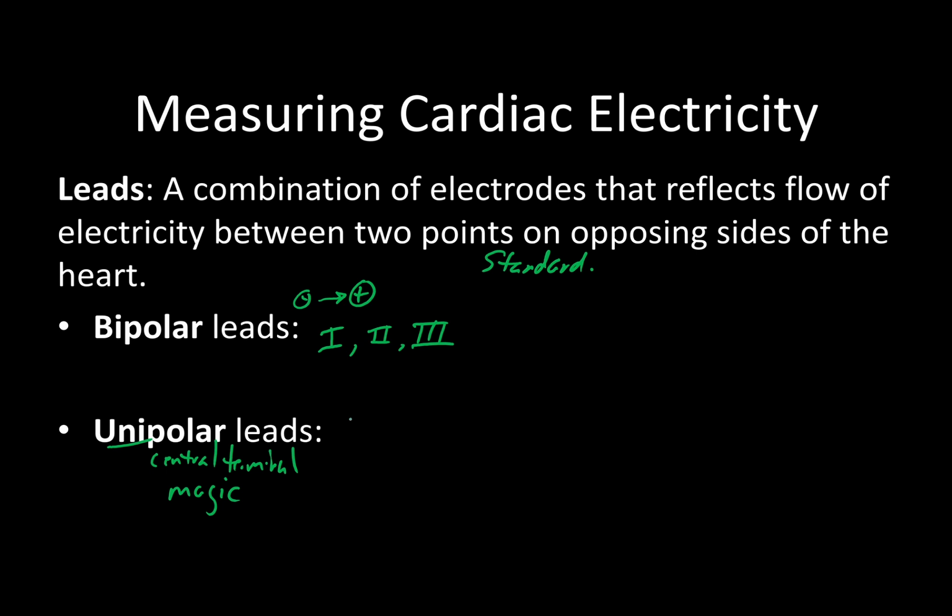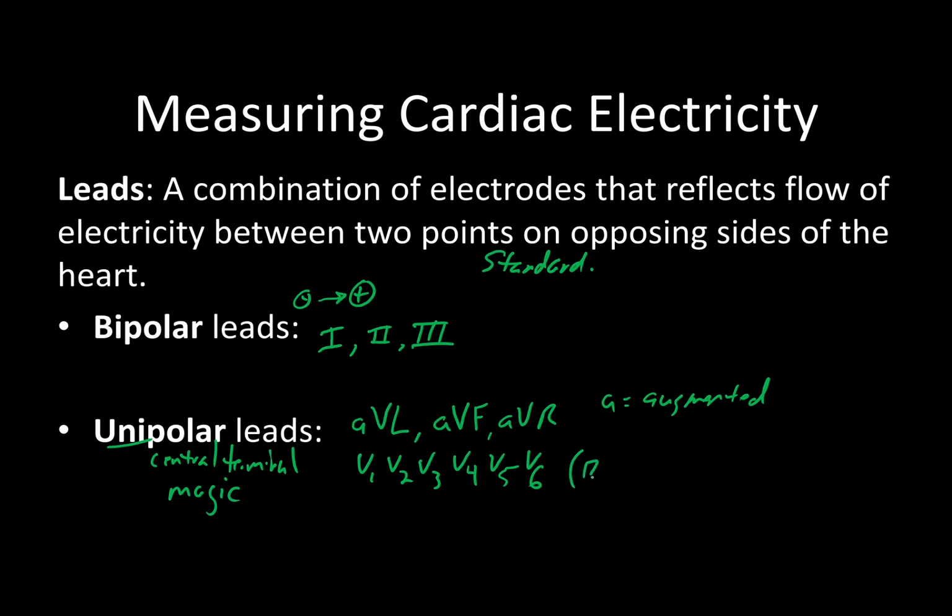And the most common leads that you will see with that is your AVL, your AVF, and your AVR. And the A stands for augmented. Now, other leads that actually use the exact same idea is your V1, V2, V3, 4, 5, and 6. And those are all part of your 12 lead.